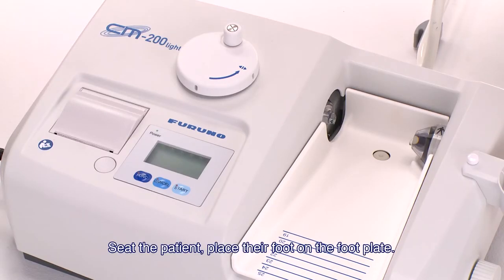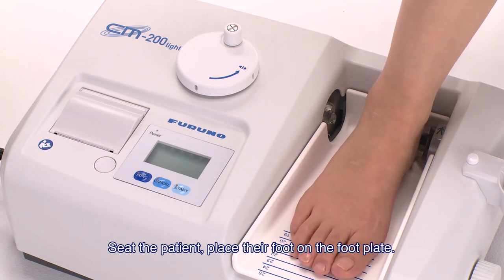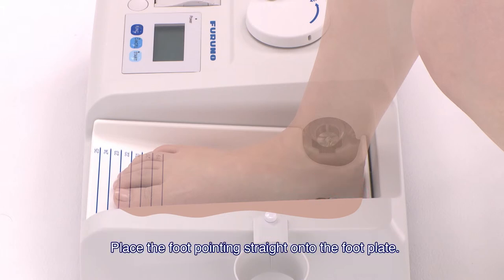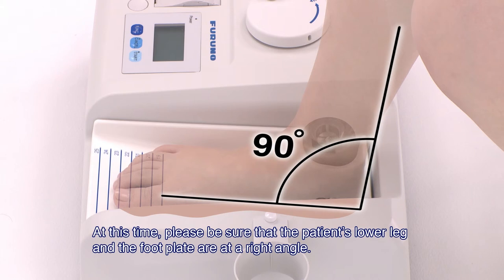Seat the patient, then place their foot on the footplate. When placing the foot, be sure to press the inside of the patient's heel against the fixed standoff. Place the foot pointing straight on the footplate. Please be sure that the patient's lower leg and the footplate are at a right angle.